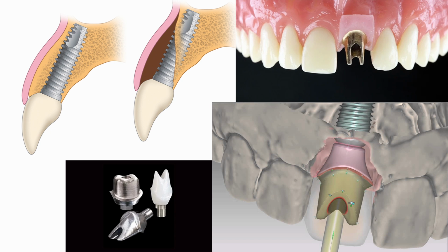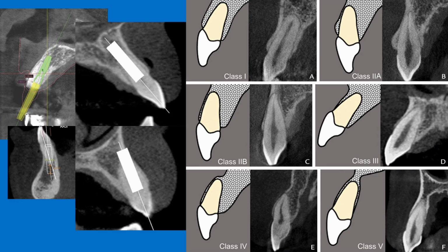Then screw retightening becomes necessary, and that becomes a serious problem. Because abutment screw loosening is a critical issue, screw-retained prostheses are often selected to allow repeated retightening of loosened screws. However, during the process of screw loosening, peri-implantitis can develop. Once screws loosen, many complications tend to follow. This directly leads to abutment screw fracture. It can also cause fracture of the fixture or the abutment.